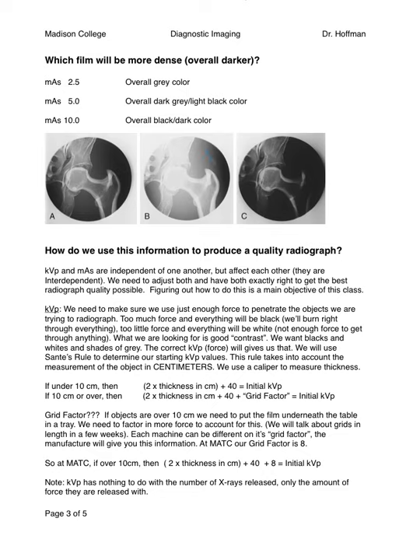This one here is our lightest looking x-ray. It's going to have our lowest MAS. And then we kind of look through. A is going to be in our middle, and if we look over here to C, it's definitely the blackest. The blacks are the blackest. That's going to be relating to our higher MAS.